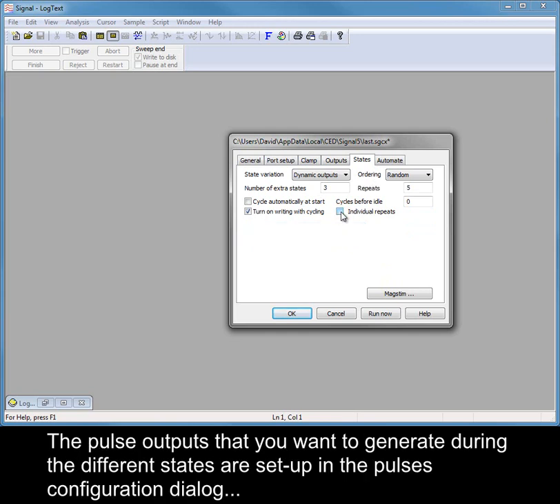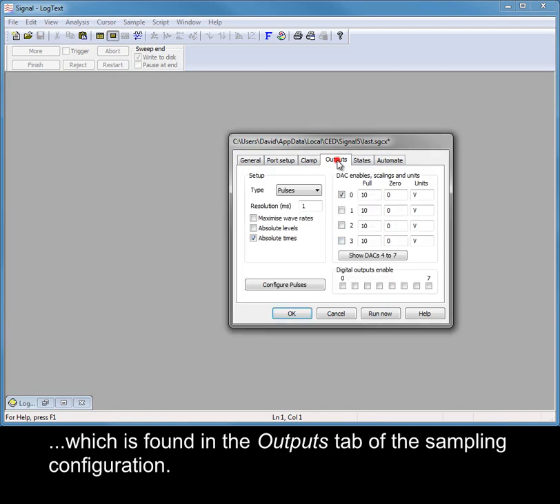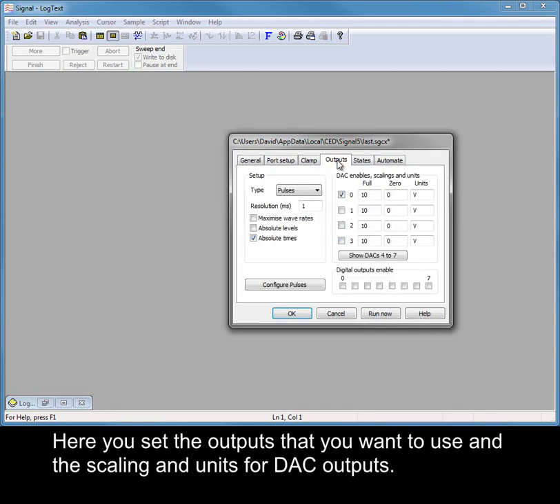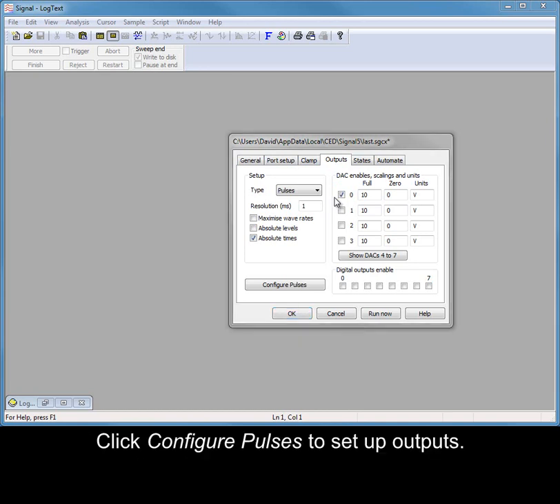The pulse outputs that you want to generate during the different states are set up in the pulses configuration dialog, which is found in the outputs tab of the sampling configuration. Here you set the outputs that you want to use and the scaling and units for DAC outputs. For this example, I am only using DAC 0 with default scaling. Click Configure pulses to set up outputs.